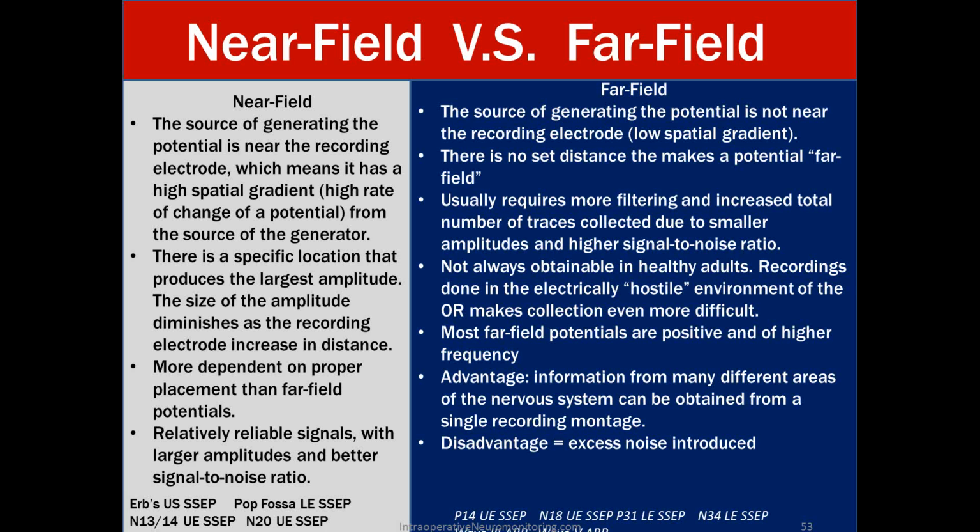Below I have some of our near field responses that you should commit to memory because that is a very easy question to be asked and answered on the CNIM. So any peripheral nerve response is going to be a near field. So Erb's point, pop fossa, the ulnar nerve at the elbow, all those are going to be near field responses.